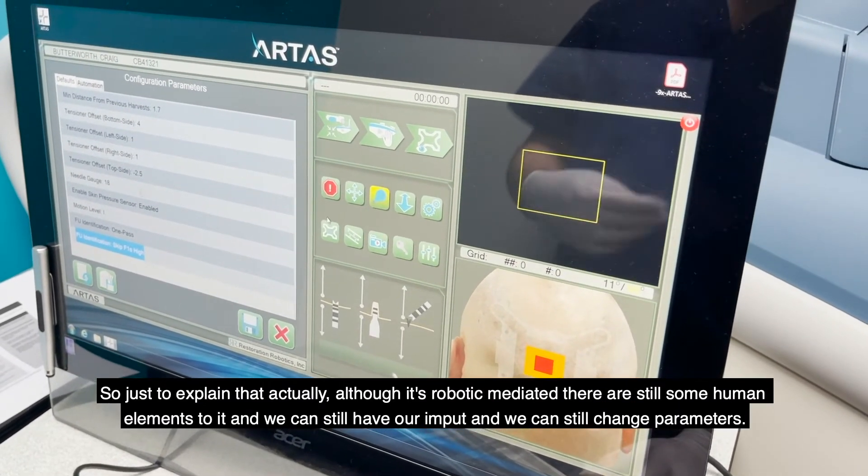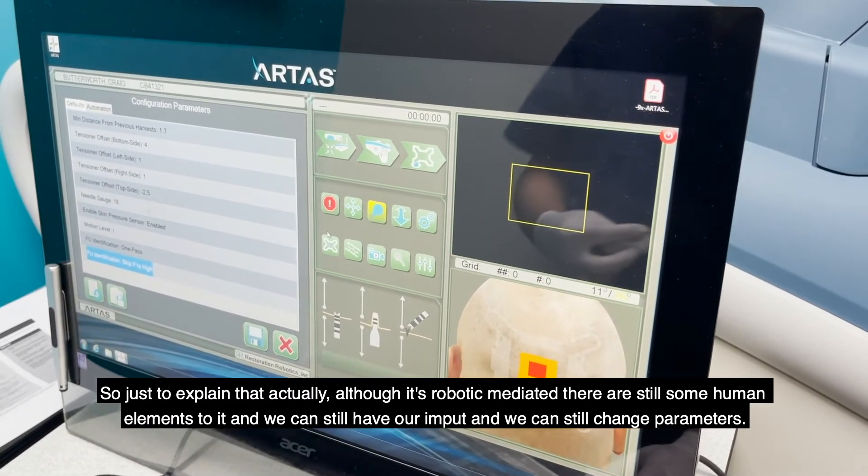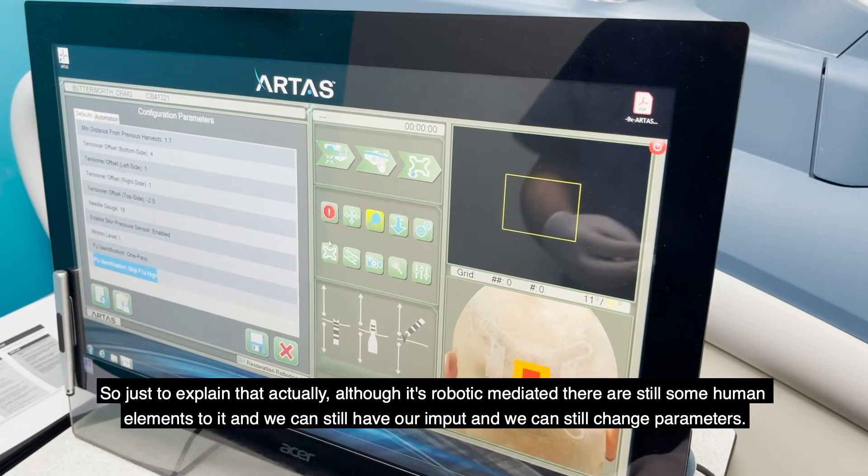Just to explain that — although it's robotic mediated, there are still some human elements to it, and we can still have our input and we can still change parameters.